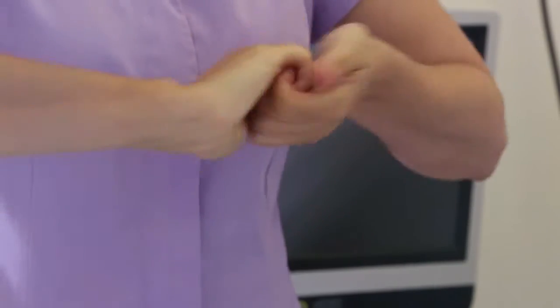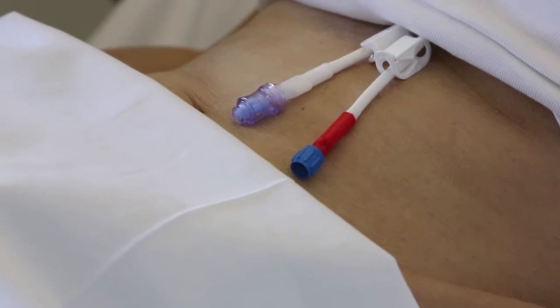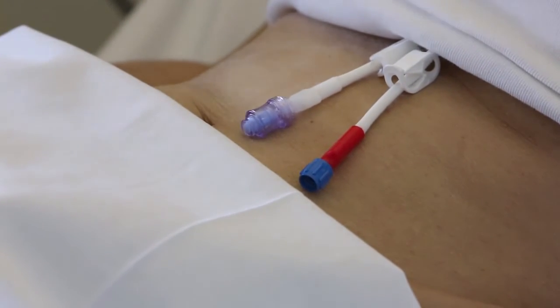Identify the patient and explain the procedure. Ensure that there are no contraindications to the drug you are going to give to the patient. Expose the patient and line appropriately, allowing comfortable access.